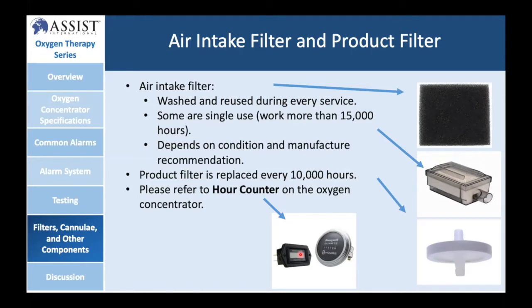Depending on what your manufacturer recommends, you want to track the hours. When you hit the limit, you want to make sure you flag this for your hospital administration or your technical teams. Listen, this oxygen concentrator has hit 30,000 hours, and I think we need to replace the zeolite tanks, or the sieve tanks. So please pay attention to this, and please pay attention to the air intake filter. And then the rest, you leave it up to your technical teams.